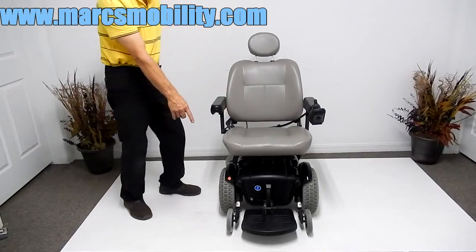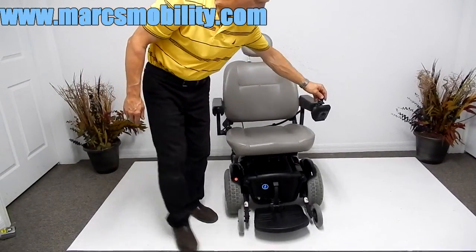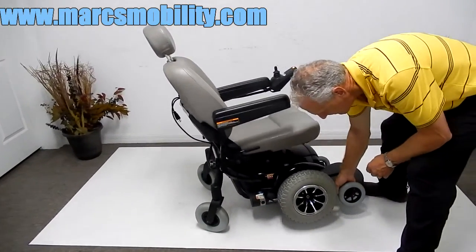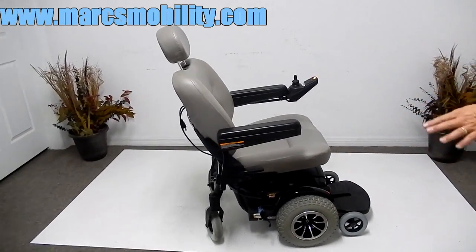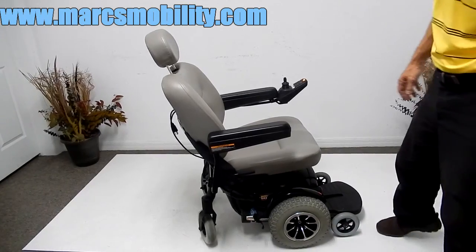The front wheels feature an active track suspension. If you look at the front wheel and I grab it and pull on it, you'll see the motor is on a spring. So you've got suspension on this chair, which is nice. These are solid tires all the way around.